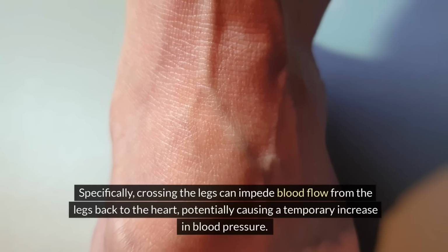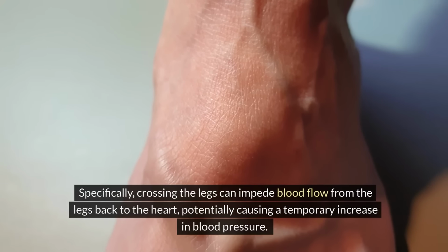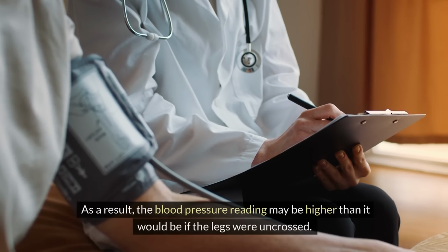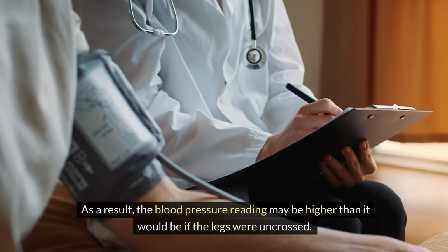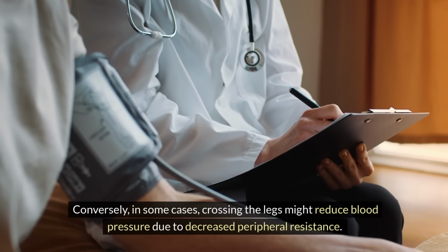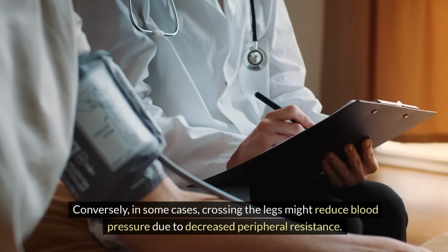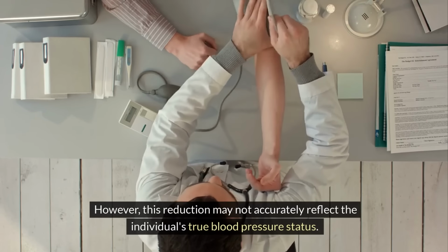Specifically, crossing the legs can impede blood flow from the legs back to the heart, potentially causing a temporary increase in blood pressure. As a result, the blood pressure reading may be higher than it would be if the legs were uncrossed. Conversely, in some cases, crossing the legs might reduce blood pressure due to decreased peripheral resistance. However, this reduction may not accurately reflect the individual's true blood pressure status.